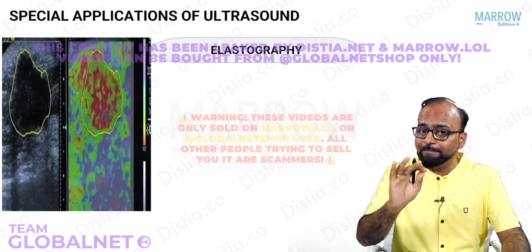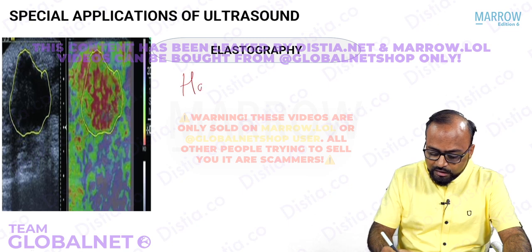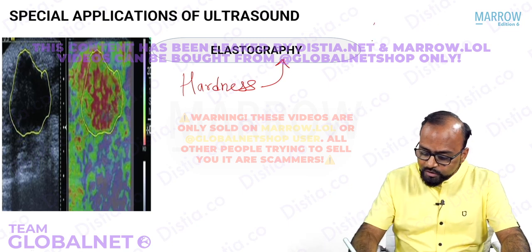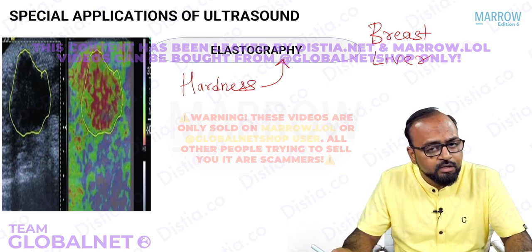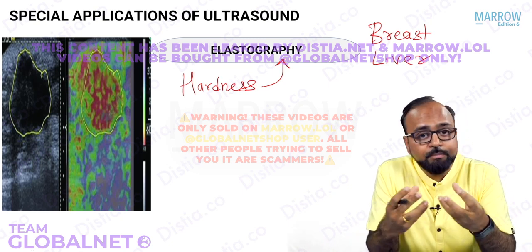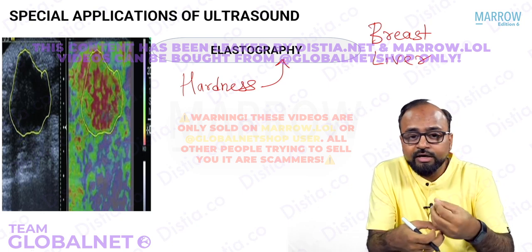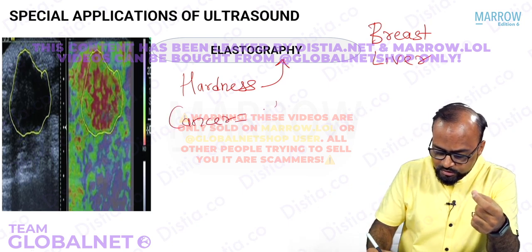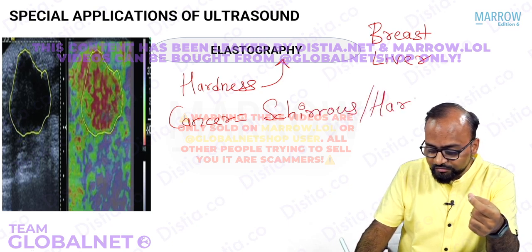Now, a special application of ultrasound is the use of ultrasound for measurement of hardness of the tissue, and it is called elastography. Now, it is most commonly used in breast imaging. It can be used in liver imaging or liver assessment, also liver cirrhosis, right? Now, we all know that a breast cyst may be pliable. Breast normal tissue is compressible. A breast cyst can also be pliable, right? But a breast cancer, remember, is known to be scirrhous. Scirrhous means it is known to be very, very hard.